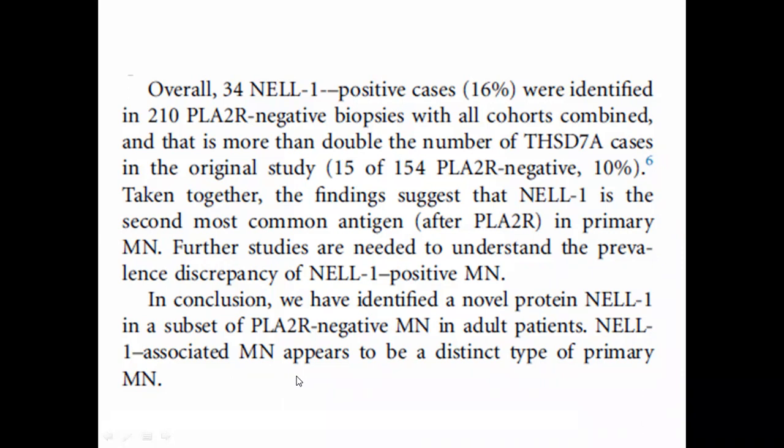No secondary cause was found. That's why. Okay. And presence of IgG3 and IgG4 is also unusual. The commonest combination I see in primary idiopathic membranous is IgG1 and IgG4. It is never IgG3 and IgG4. So that also is unusual. Yes, I understand when you say that no secondary cause was found, because I must tell you that there are some cases which we are still missing.